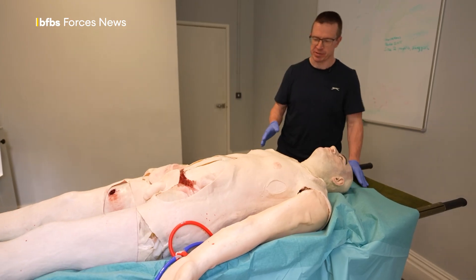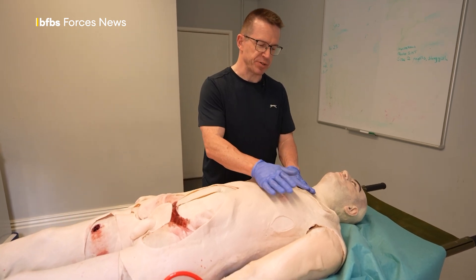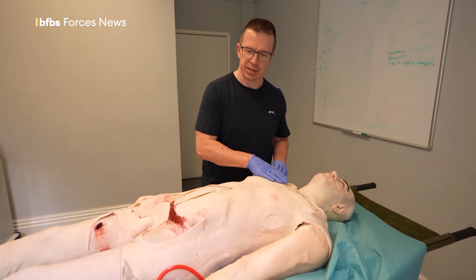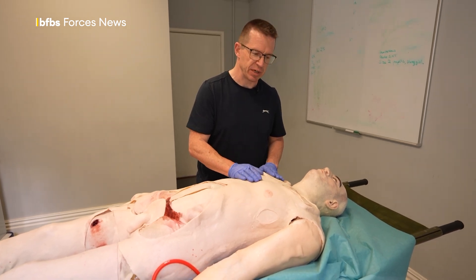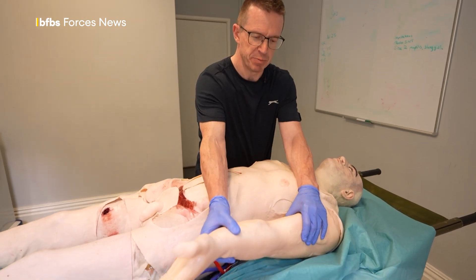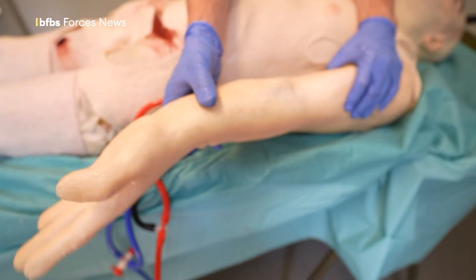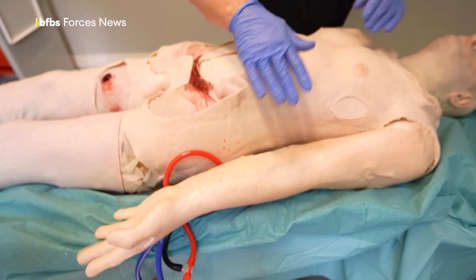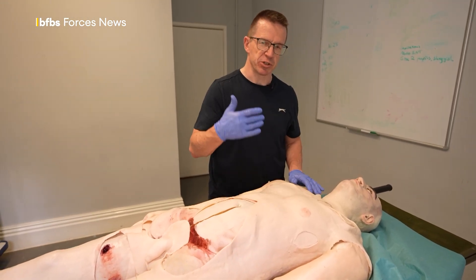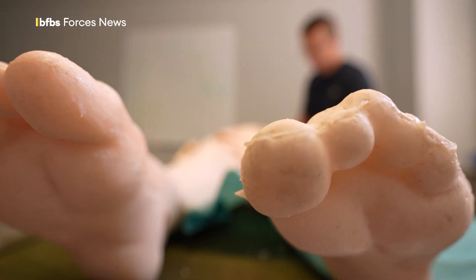Another important feature is that the model, when it's all put together, weighs about 55 kilos — less than a man of this size, which would probably be more like 75 or 80 kilos, but still has a realistic weight to it. So when you lift a limb and move it, it feels heavy. All of these little features just help to reinforce the realism and help people with the immersion into the simulated scenario that they're going through.